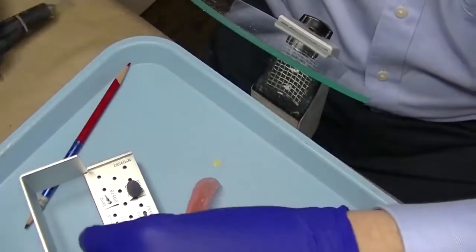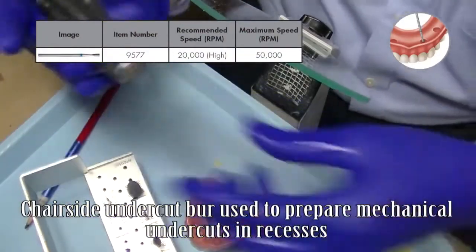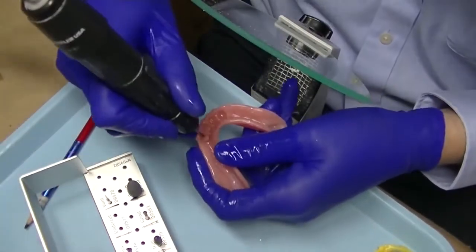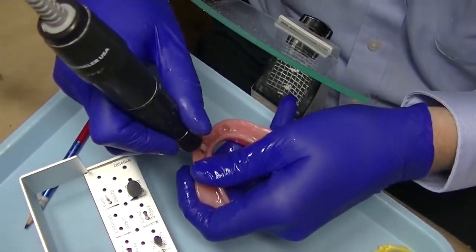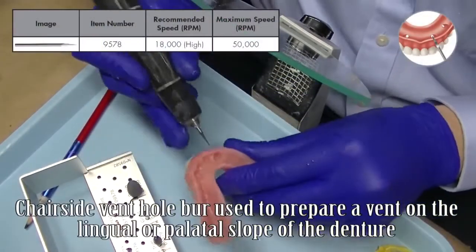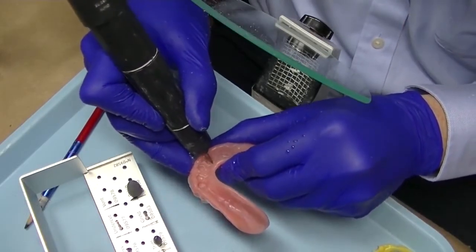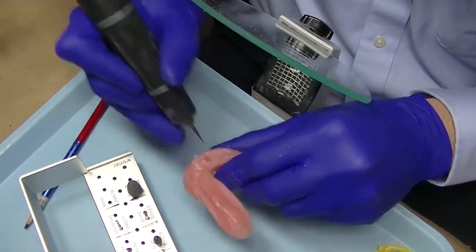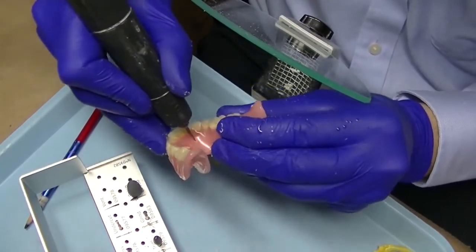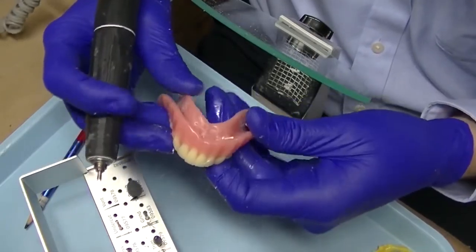The denture is taken back to the laboratory where the chair side undercut burr is used around the recess preparations to prepare mechanical undercuts. Mechanical undercuts aid in retention of the chair side attachment processing material during the attachment pickup. The vent hole burr is also utilized to create a lingual or palatal vent for the attachment processing material to easily vent or flow out through the holes of the lingual or palatal surface of the complete denture, minimizing any chance of pressure on the ridge.